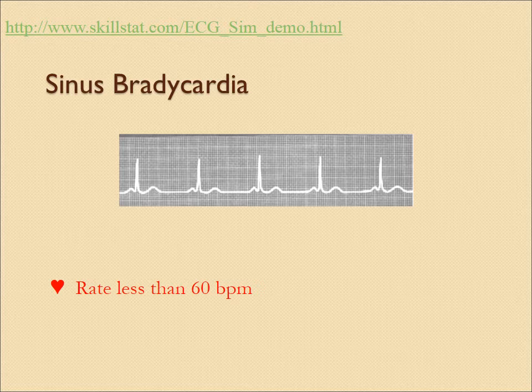So is it regular? It's marching out regularly, yes. Is there a P before every single one? Yes. Is our PR normal? Yes, it is. Is our QRS normal? Yes, it is. So everything's normal except the rate, and that's what makes it sinus bradycardia.